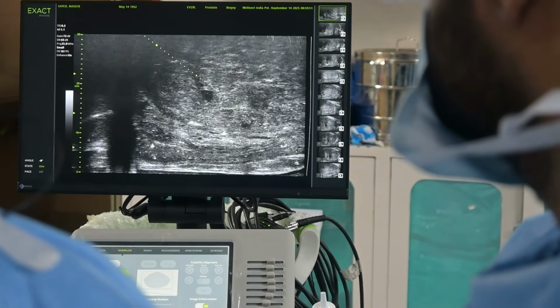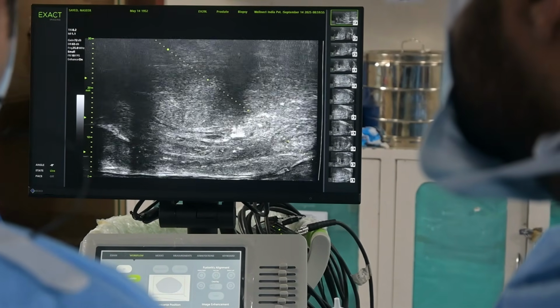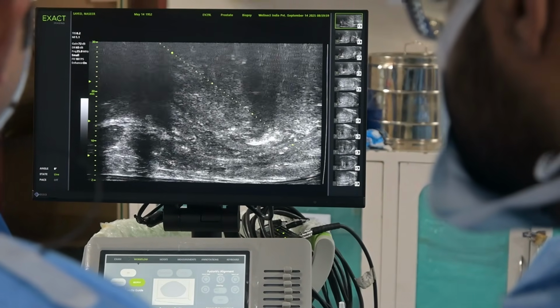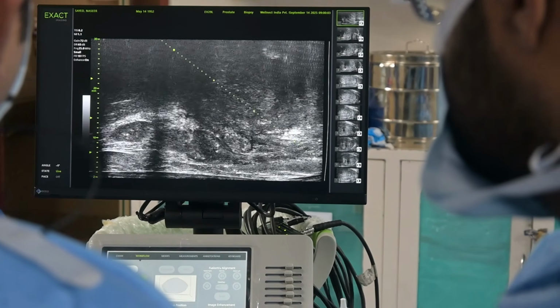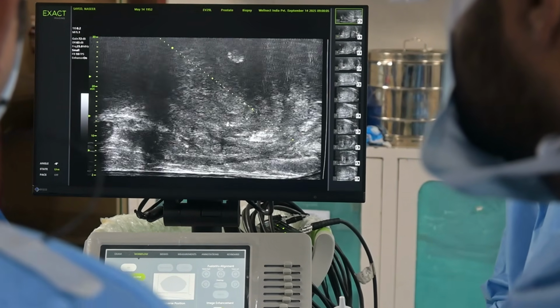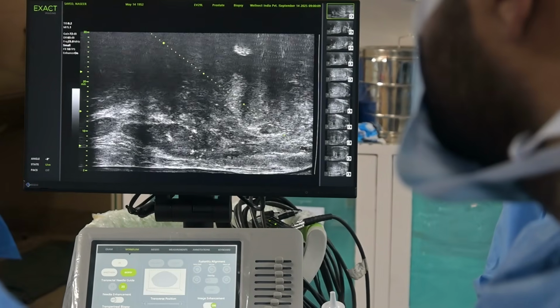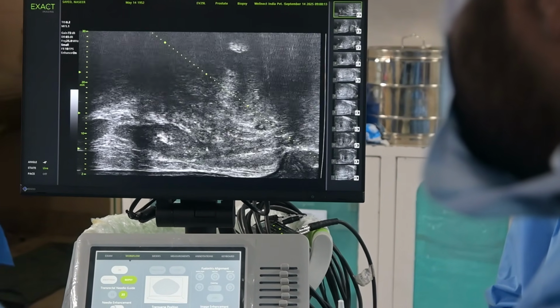Now I will do systematic on the left. So again, see, this is midline. How am I telling midline? Because the angle here tells me. Without seeing the urethra also, the angle tells me. Okay. Now you can see the seminal vesicle. Okay, so I am near the midline at this point, at the base of the prostate. Okay. Yeah, we can see the needle coming.